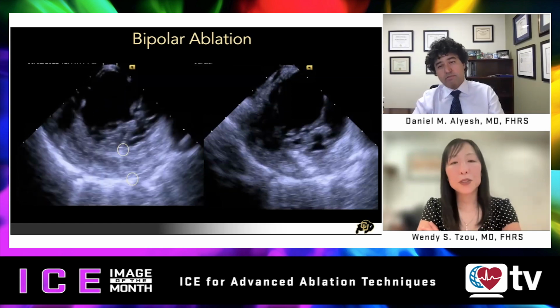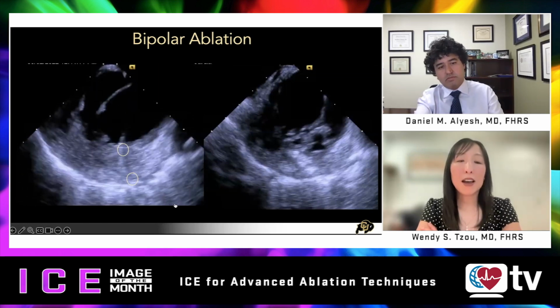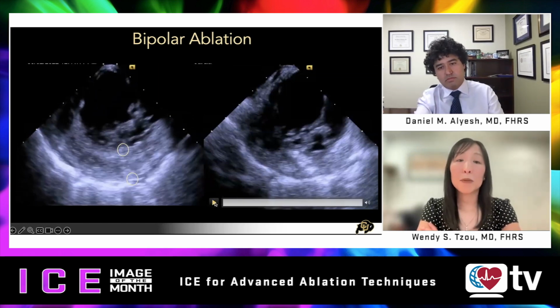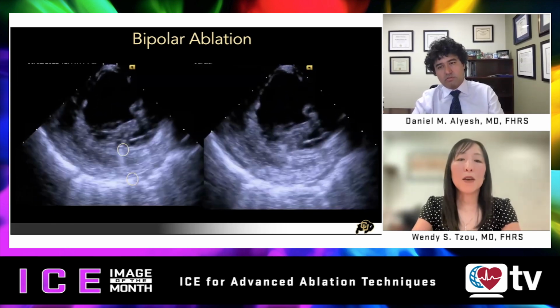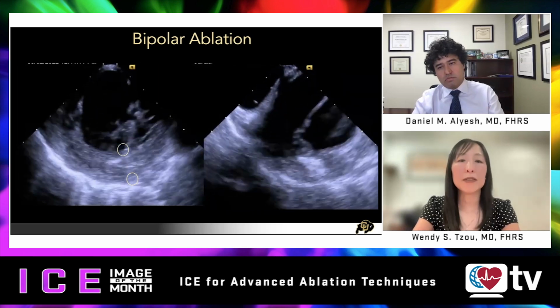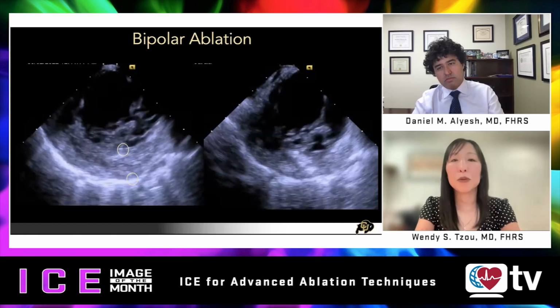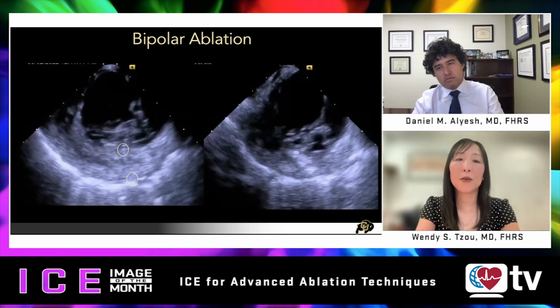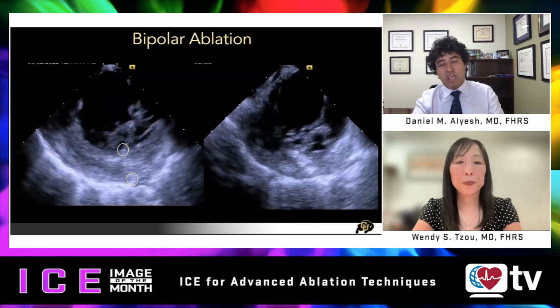Okay. And so I will sometimes, it depends on kind of limitations and impedance. And sometimes there can be a significant impedance mismatch, especially in this unusual case where I'm doing bipolar with one of the catheters within a very tight space, which inherently has a high impedance. And so it might be more feasible. It was, in fact, more feasible in this case to make the active catheter the one that had the lower baseline impedance to begin with. Thank you. Thank you. Yeah.